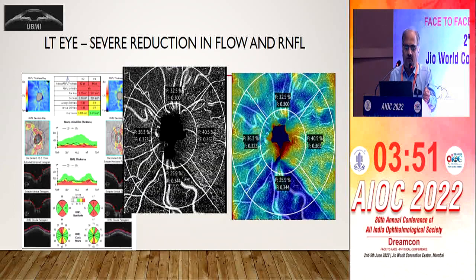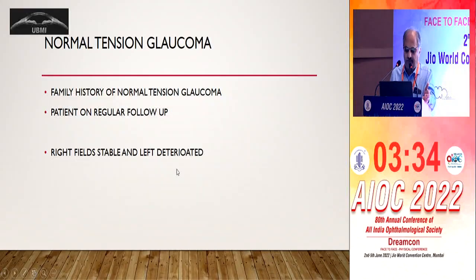A severe loss of function on the left side with its 67, 68 here, and you can see that there's almost loss of the capillaries along the arcades. Even the superficial plexus are gone. Therefore, we are seeing this white hue, which is actually the deep plexus coming up. The values are 32 and 34.